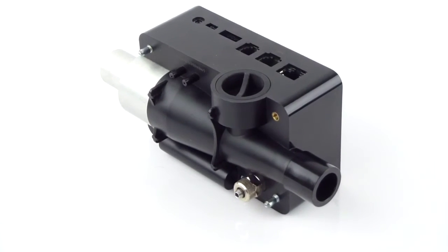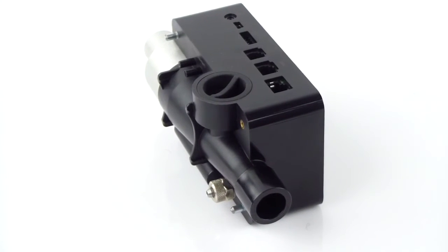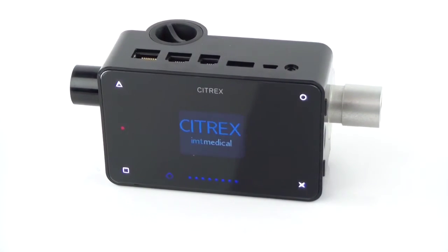The device is especially impressive due to its size, low weight and robustness. All required components are integrated and the battery enables prolonged independent use.